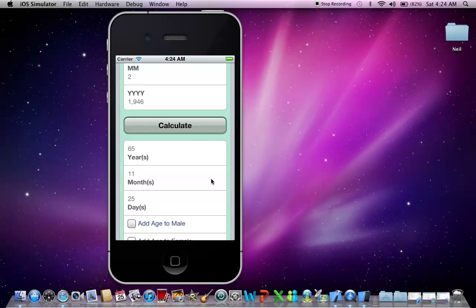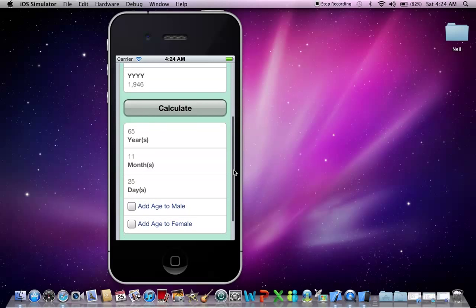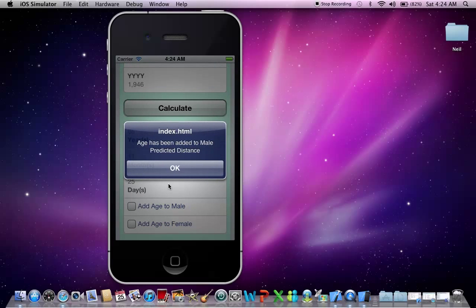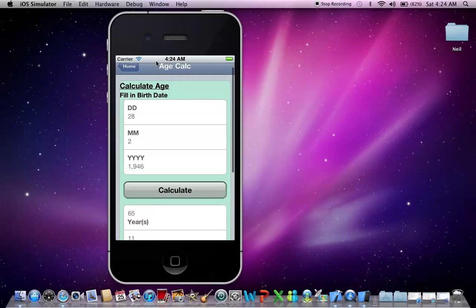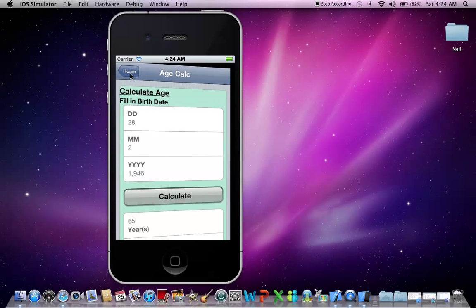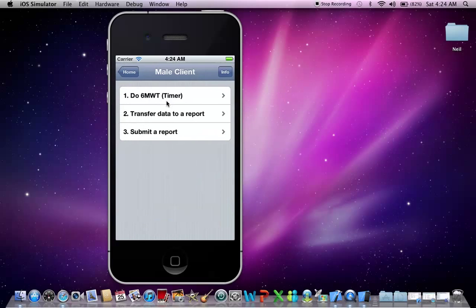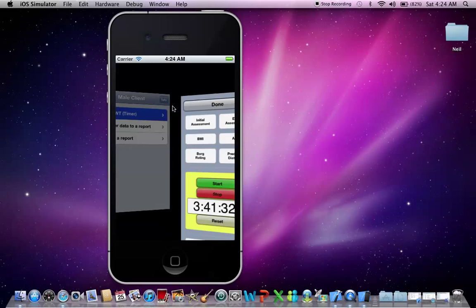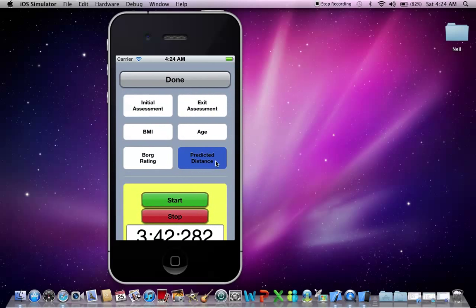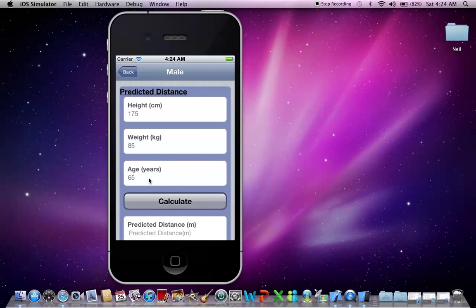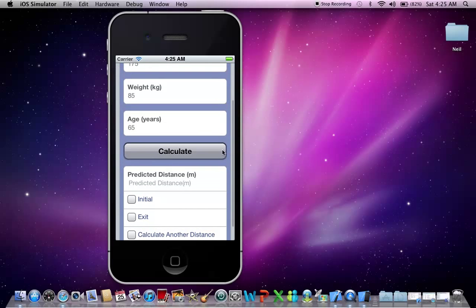Okay, so you can see that the client is very close to turning 66, but is technically still 65. So let's add that in to the predicted distance. Okay, let's go back up and go to the predicted distance. And there you can see the age has been transferred. So that's a nice nifty tool if you're Generation Y like myself, who has trouble calculating ages.